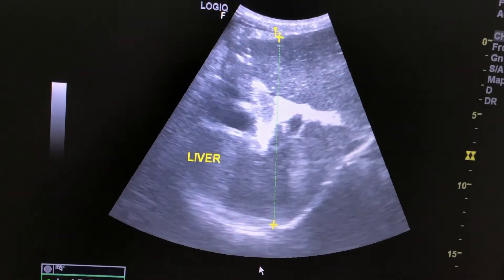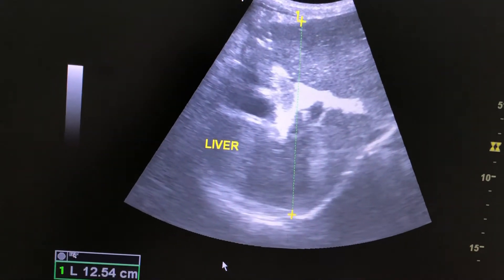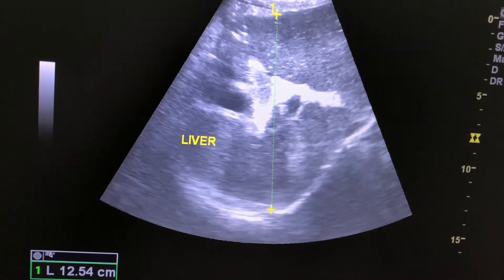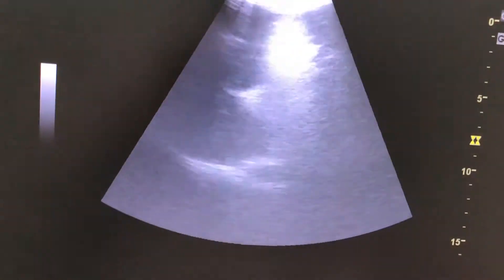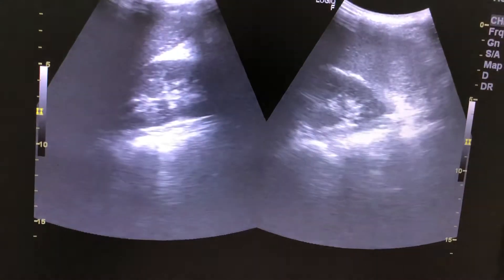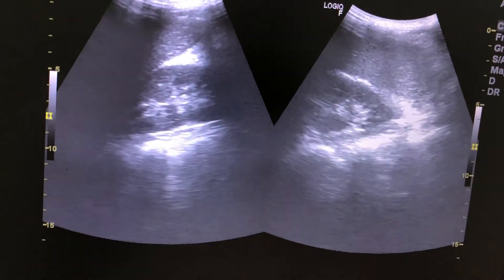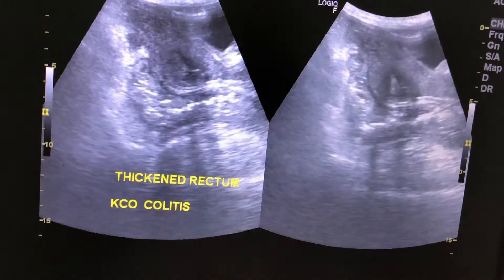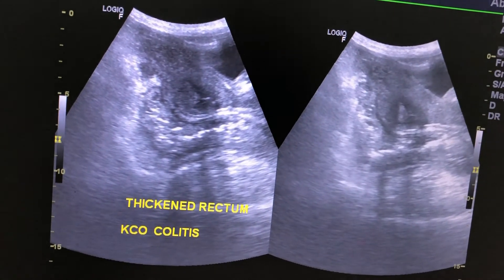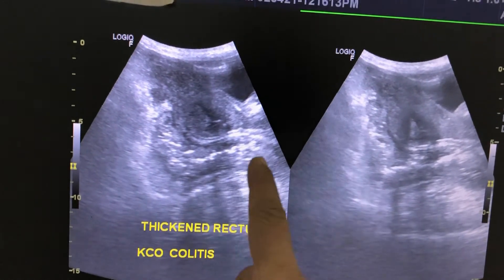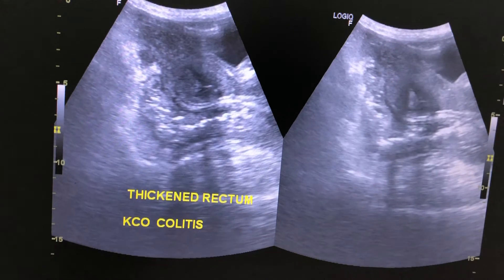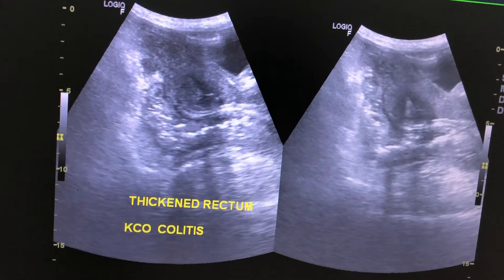The liver is normal at 12.5 cm. This is the kidney. The rectum is thickened, in keeping with the known case of colitis.